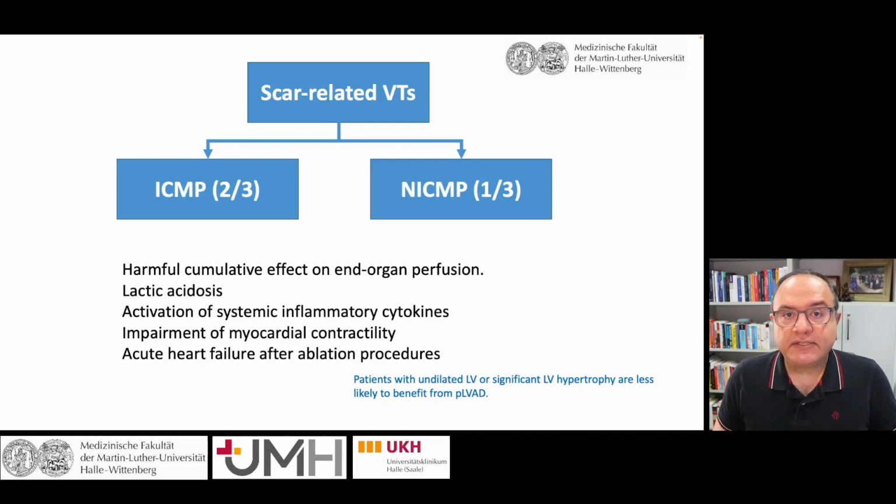The VT in this constellation is more complex and usually the procedure is longer, and we need some endo and epicardial approach to finally ablate the clinical and all inducible VTs and modify the substrate. So the procedure is usually longer and more complex, and that's the reason why we usually use hemodynamic support during catheter ablation of VT in patients with non-ischemic cardiomyopathy.